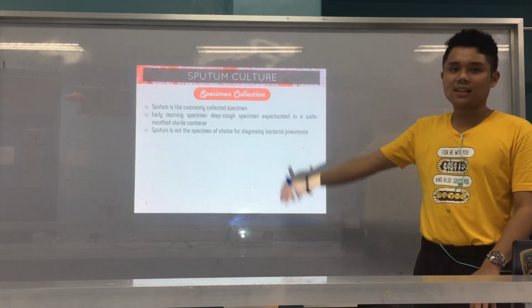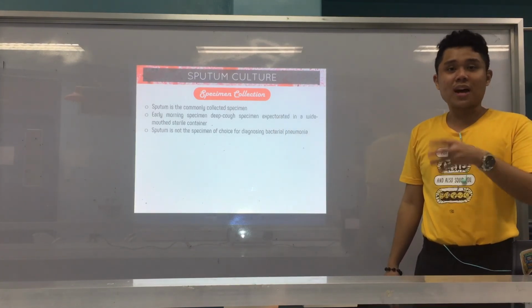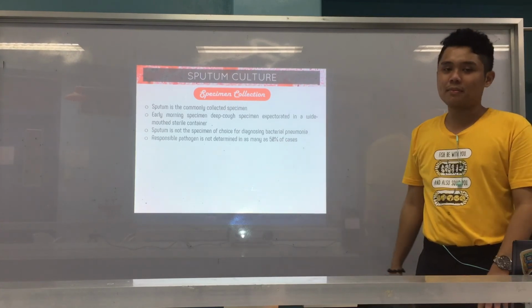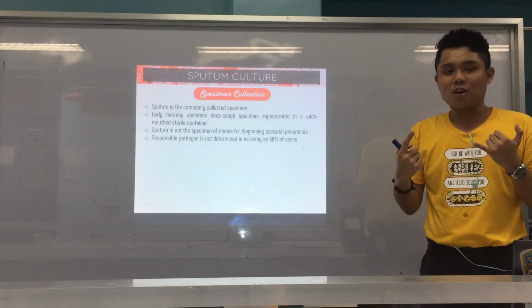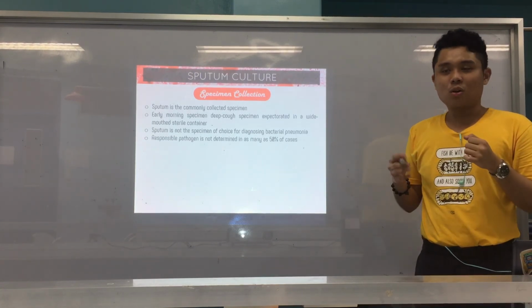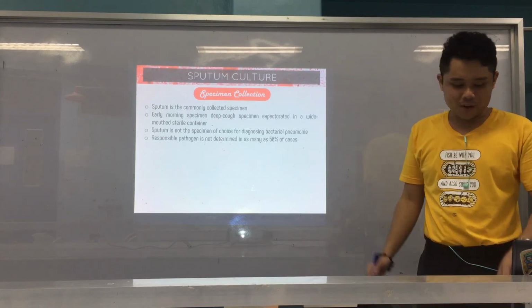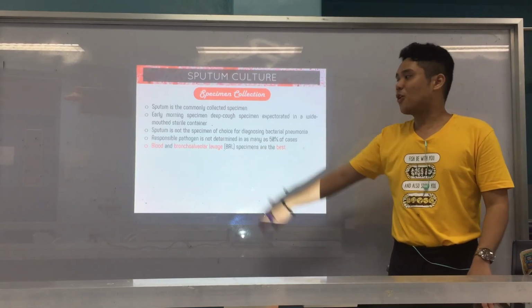Sputum, again, is not the specimen of choice for diagnosing bacterial pneumonia because it passes through the mouth, which contains a lot of normal flora. The responsible pathogen is not determined in as many as 50% of the cases. Why? Because of the contamination from the mouth. Aside from that, during collection, what if the patient doesn't do a deep cough and just spits out saliva? So it's not really diagnostic. Therefore, the best specimens are blood and bronchoalveolar lavage.